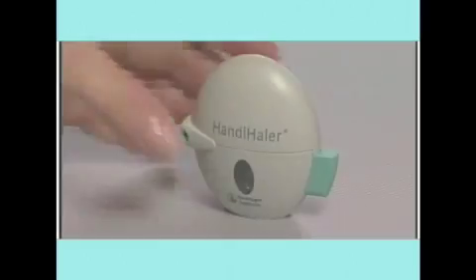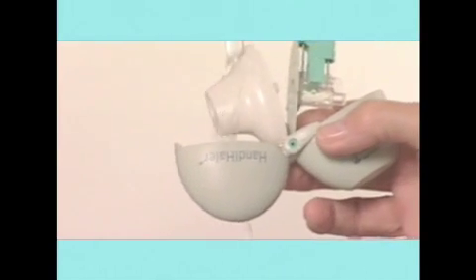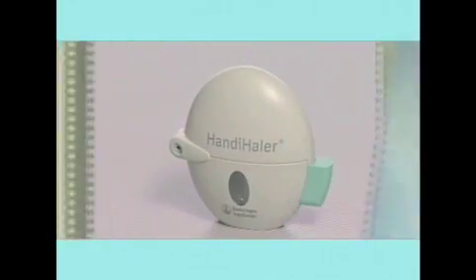The Handihaler needs to be cleaned about once a month. To clean the Handihaler, open the lid and lift up the mouthpiece, then lift up the piercing button to open the base. Rinse the Handihaler with warm water to remove any powder — soap is not required. Do not place the Handihaler in the dishwasher. Dry the Handihaler completely by tipping out any excess water and leaving it to air dry for 24 hours with the lid, mouthpiece, and base open. The best time to clean your Handihaler is right after you use it, so that it will be dry and ready for your next dose on the following day.